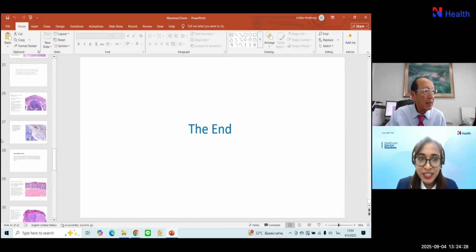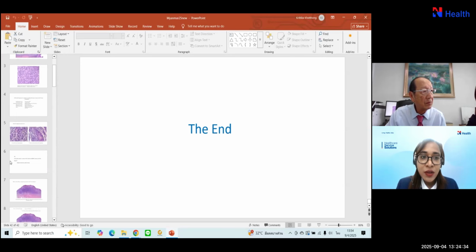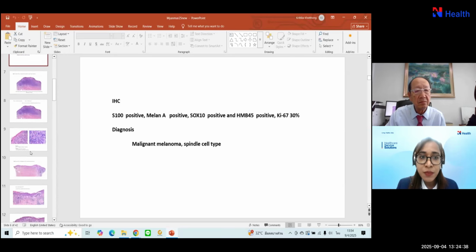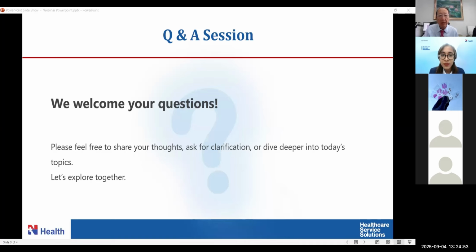So our first question is, Professor, continuing with case 3, the participant is wondering if that could also be lentigo maligna melanoma. Yes, it is. We can call it that; lentigo maligna melanoma is a clinical term. In the clinical term, we just say that if it's melanoma in situ, it's okay now.